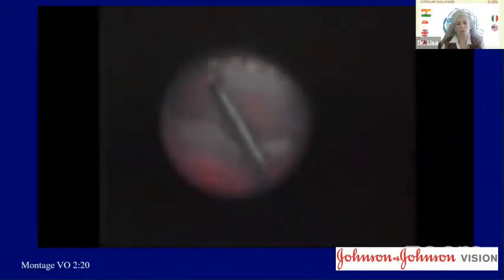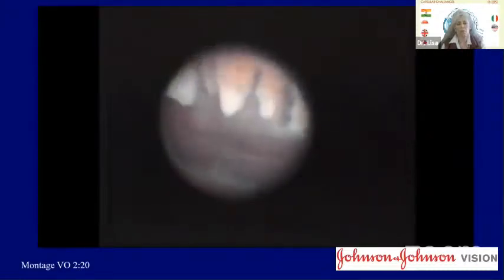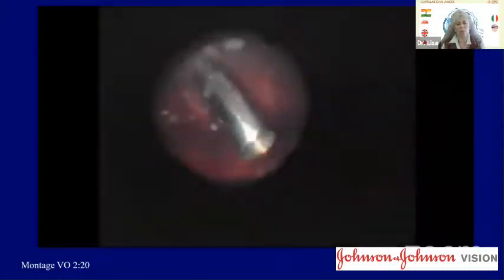Now, this is a regular three-port vitrectomy, and it's just an endoscopic view of this 23-gauge incision that was made directly. You'll be able to see that the reason it's absolutely critical we have a scleral tunnel incision, if we're not going to suture and want to be transconjunctival, is that here in this complete vitrectomy, you can see the kind of gaping hole that is there, and we would be filling that with vitreous.